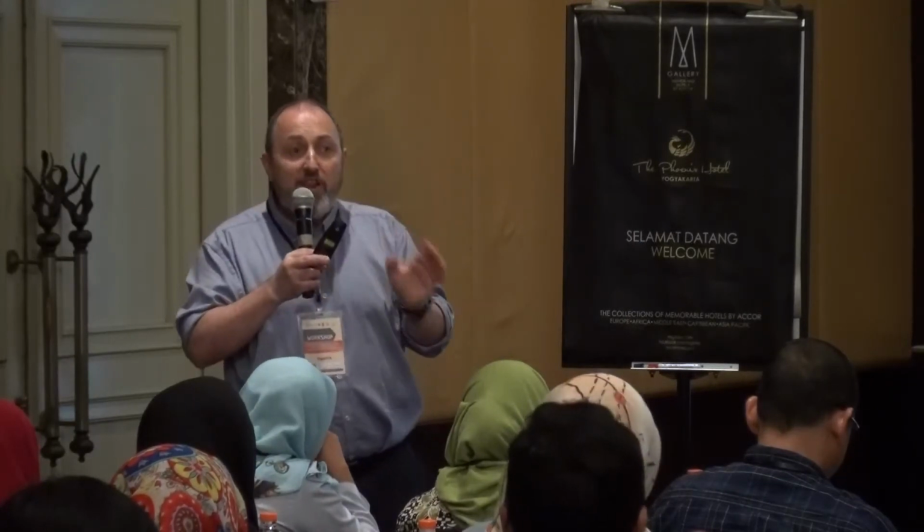Check for shoulders. Shouldering is a good sign. Overshoot and recovery, not a great sign. And the third sign you want to avoid is where you've got a pattern of no shoulders at all, absence of shouldering. Variable decelerations have a varying effect on the baby, which is why you want to look at all of the other features of the tracing and the overall clinical picture to tell you how that baby's doing.